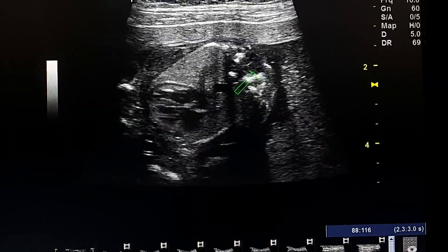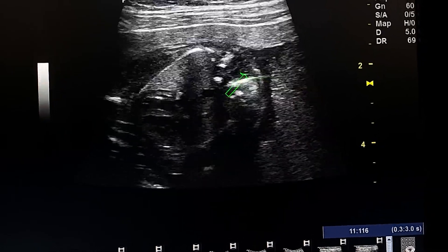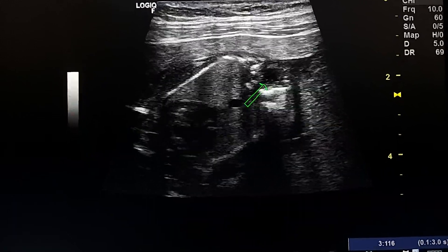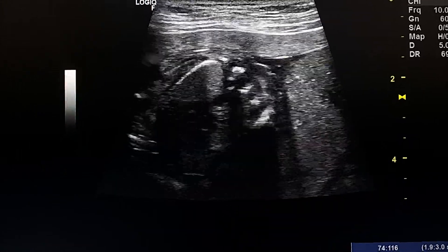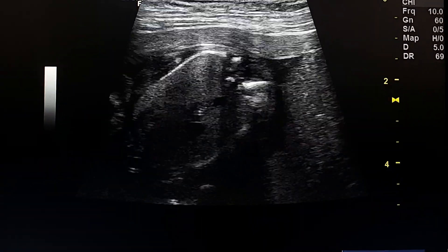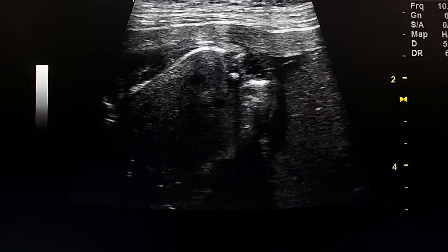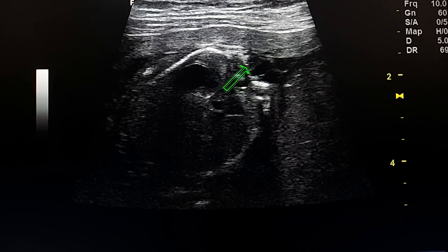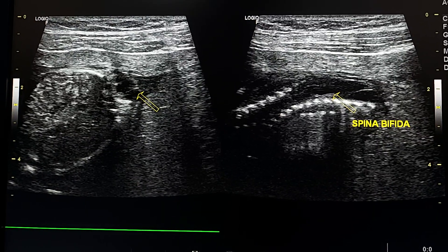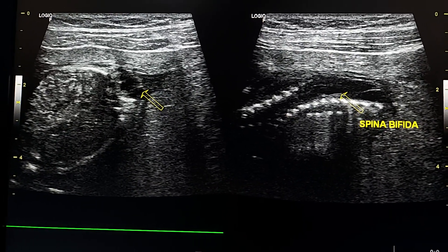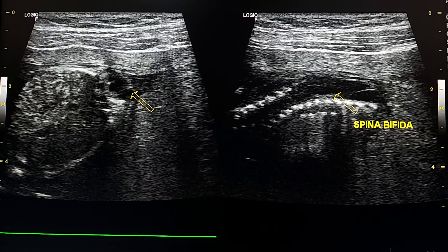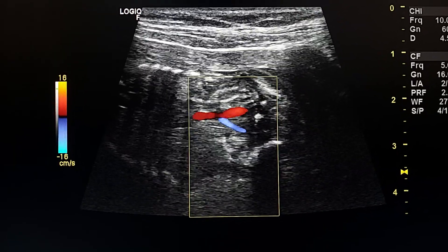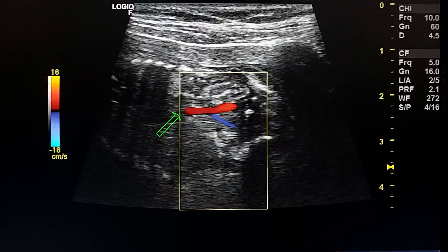This is a spina bifida in the lumbosacral vertebral column. Here is the spina bifida.